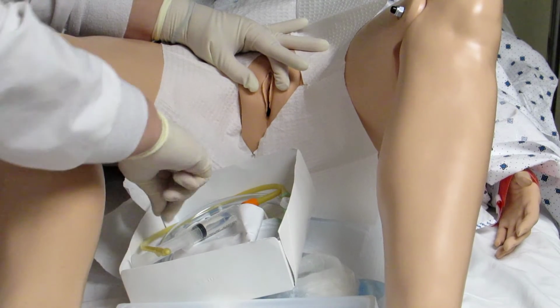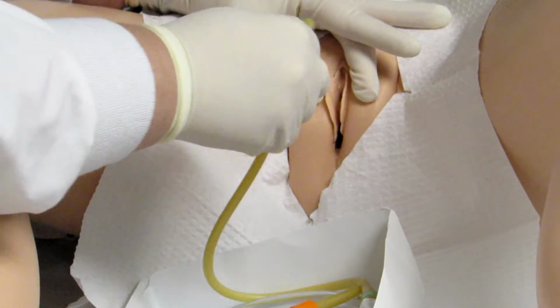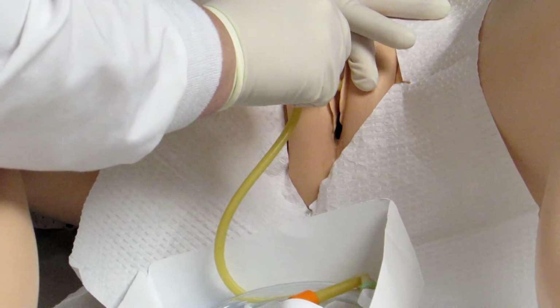Now I'm ready to insert. Here I have my catheter. It's all lubricated up. I'm going to make sure I don't contaminate it. I have it in my hand here and in the sterile field. I'm going to go right.